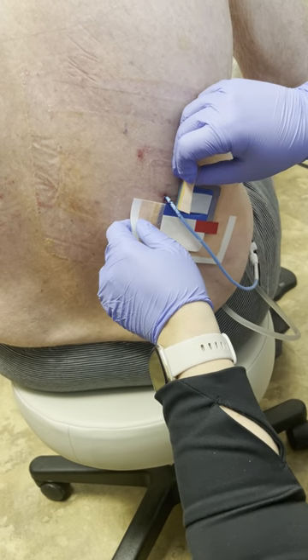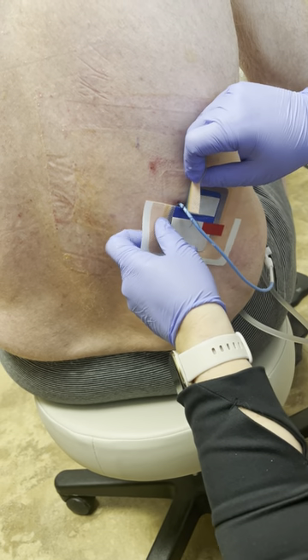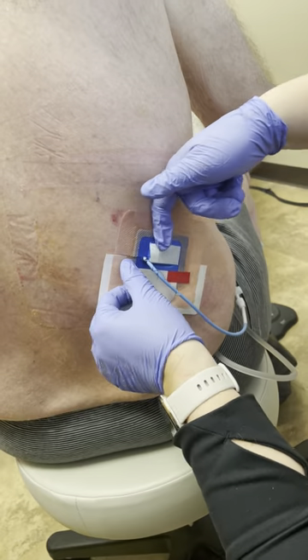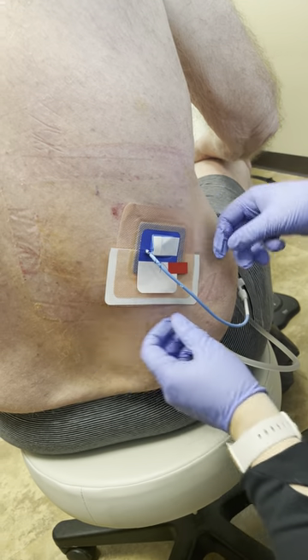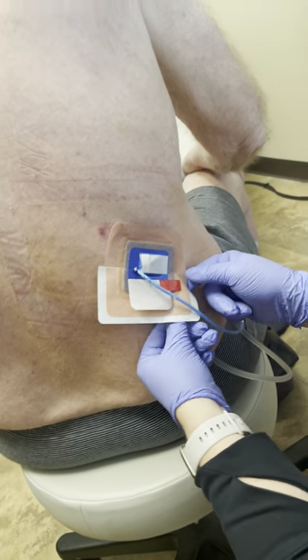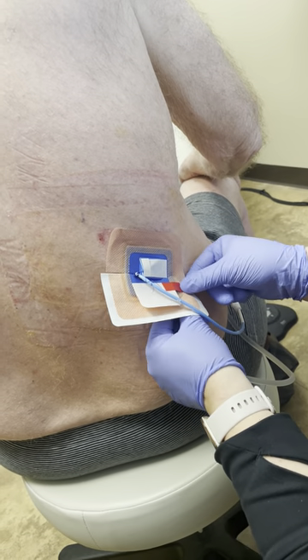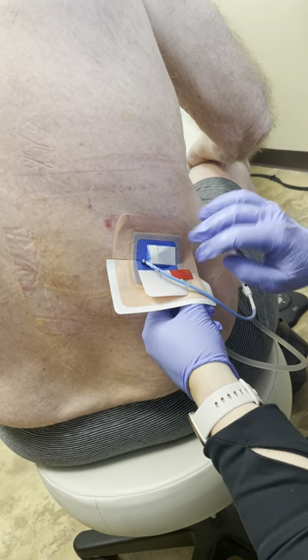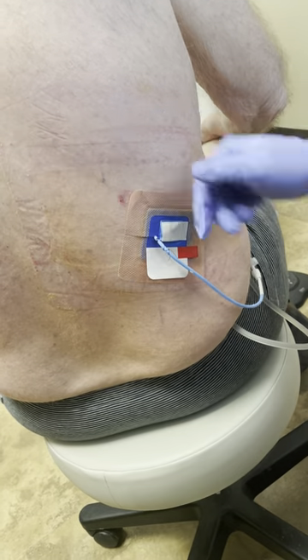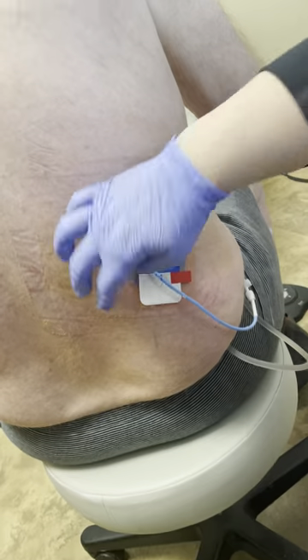This just opens like that, and you want that tube to go right in the center, and then this side goes on just like that.